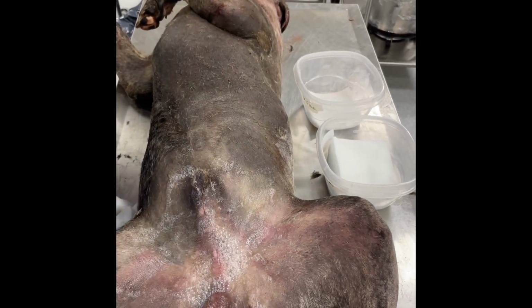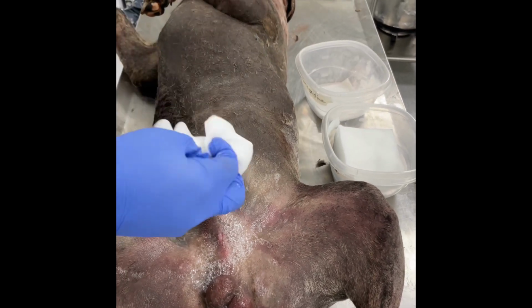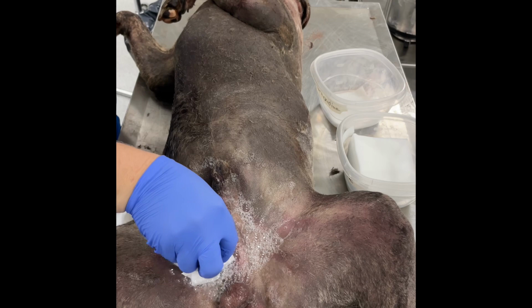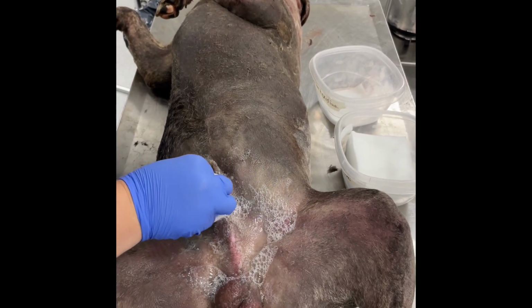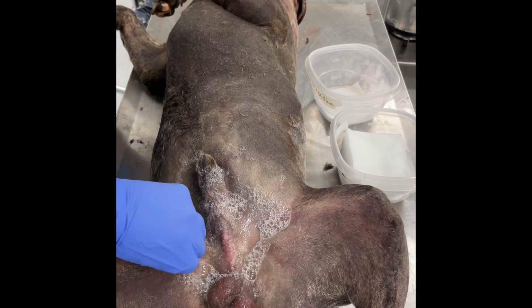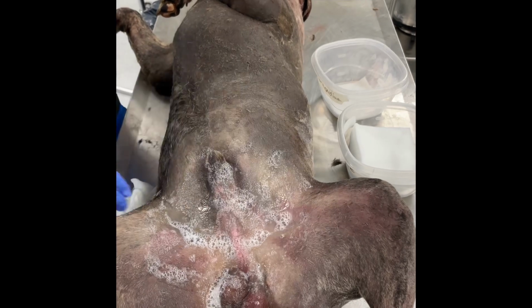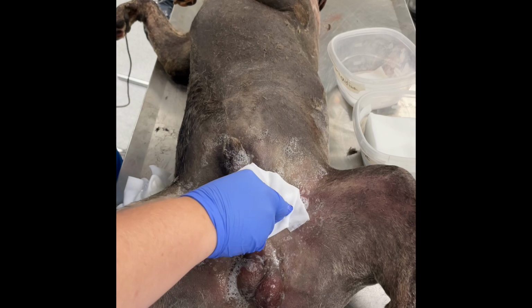The classic way to scrub a neuter is to lay your gauze down and do your circles. When you do your circles, it's important to remember that you're turning the gauze at every corner so that the outside or the dirty side of the gauze stays to the outside, and then the cleaner side of the gauze stays to the inside. Because a neuter is such a small space, and because there's a prepuce involved and there's testicles involved, sometimes it can be a little difficult to achieve the circles without contaminating your space.